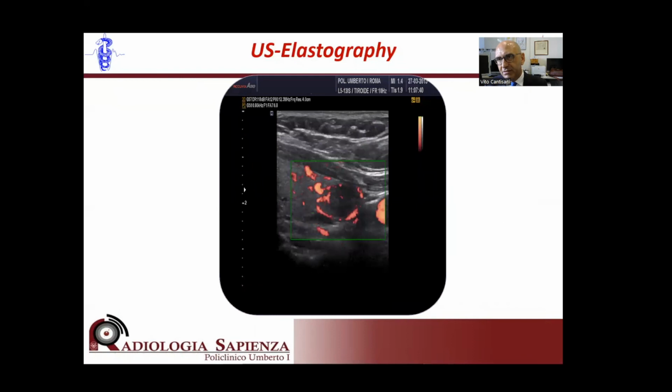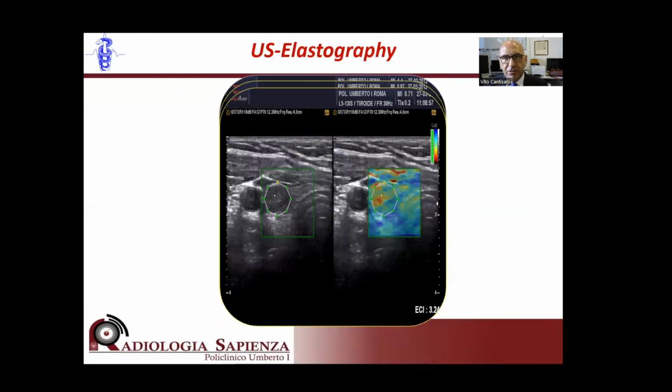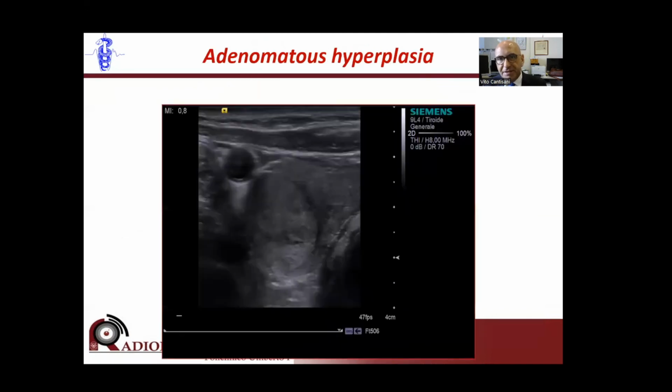Other techniques are carotid pulsation based, such as the quasi-static technique. And together with other experts in the literature, we proved that this technique can also achieve accurate results, but with different cutoff values compared with other techniques.